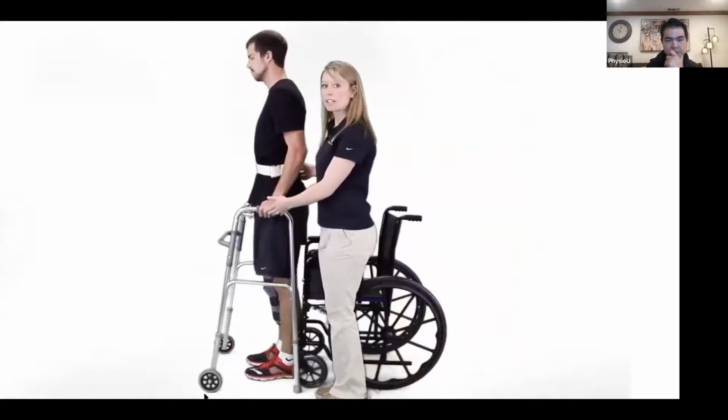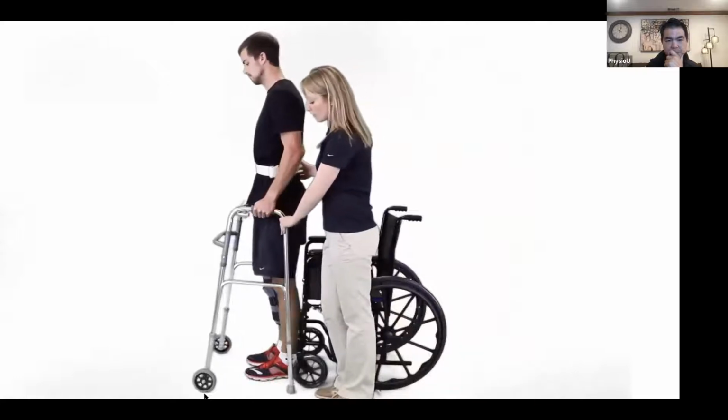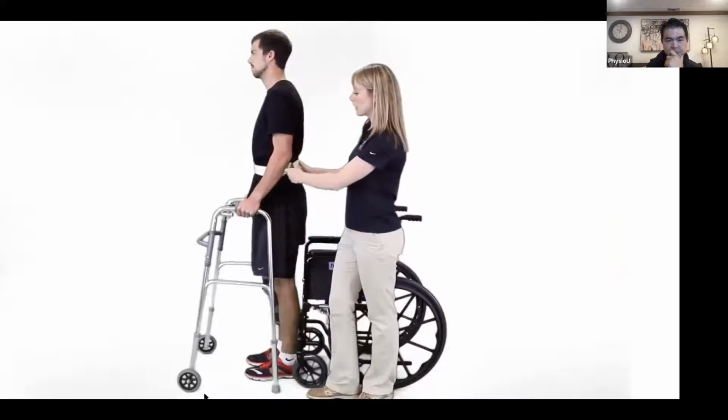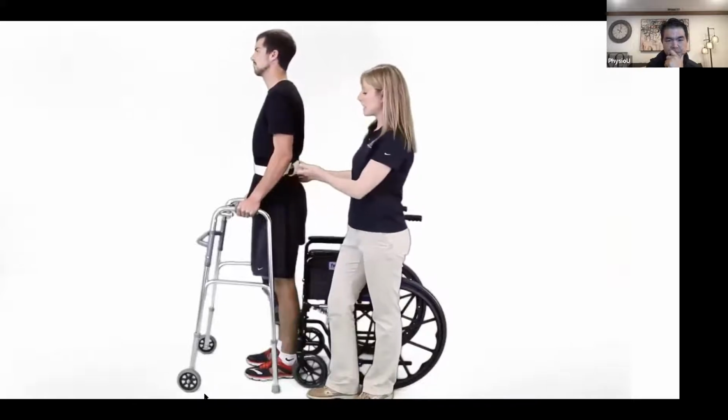With the patient holding onto the handles, you will bring the walker 4 to 6 inches forward. You will then look for 20 to 25 degrees of elbow flexion as seen here.